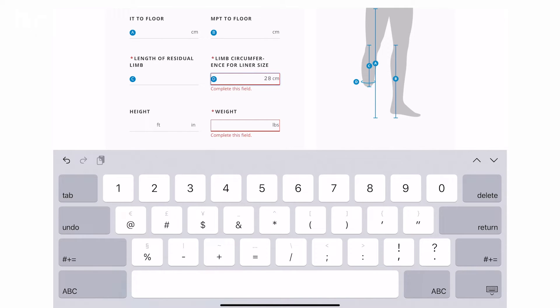This patient has a size 28 seal-in X-liner. His weight is 180 pounds and he is 5 feet 10 inches.